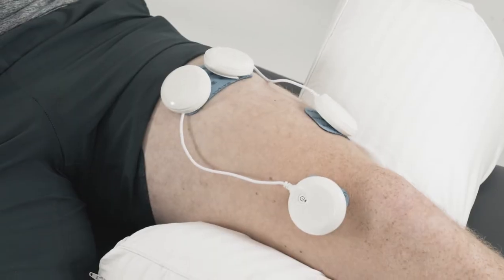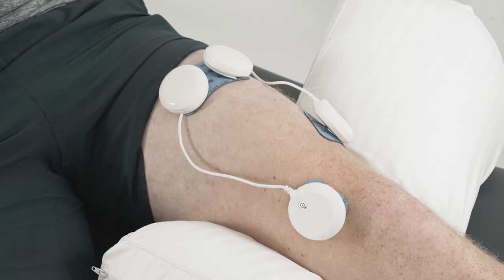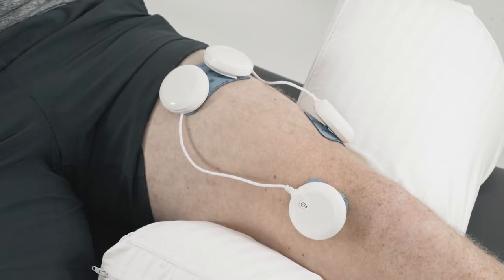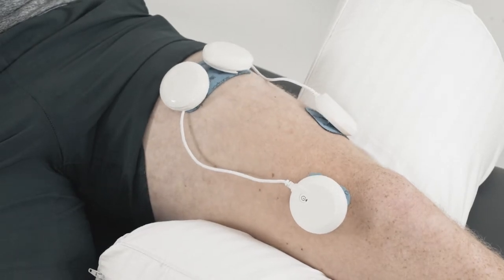As part of our rehab protocol, we want to start with a basic static quadriceps exercise. Postoperatively, this is a really important exercise purely because it doesn't put the knee under any load and it doesn't aggravate the patient's symptoms by taking them through an uncomfortable range of motion. What we have here is our electrodes in place taking VMO and vastus lateralis, as well as a reference point up on rectus femoris.